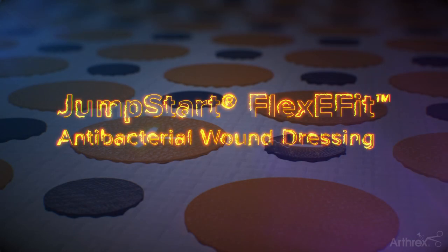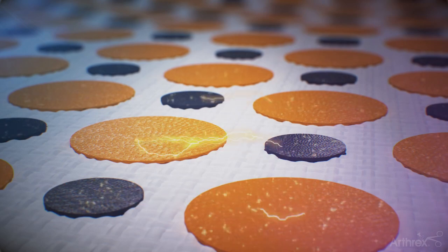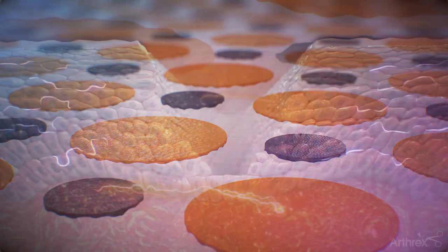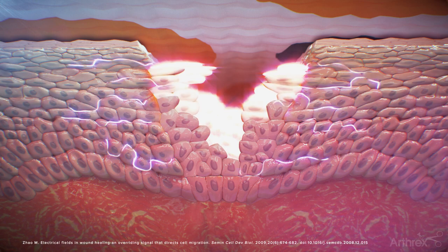The Arthrix Jumpstart Antibacterial Wound Dressing utilizes a patented technology of embedded silver and zinc islands that, when hydrated, generate a physiological microcurrent through the dressing. The presence of the microcurrent has been demonstrated in studies to promote an optimal environment for wound healing.